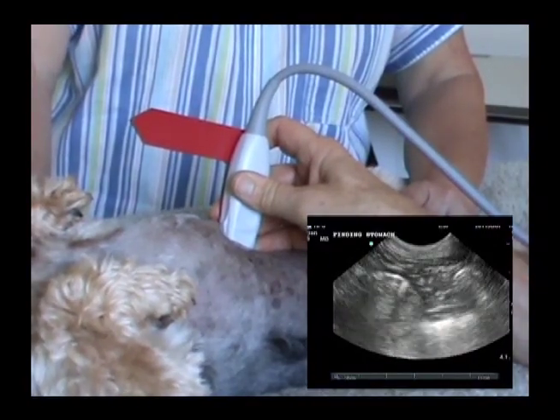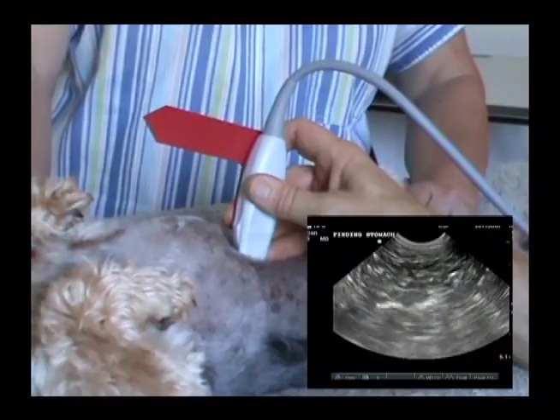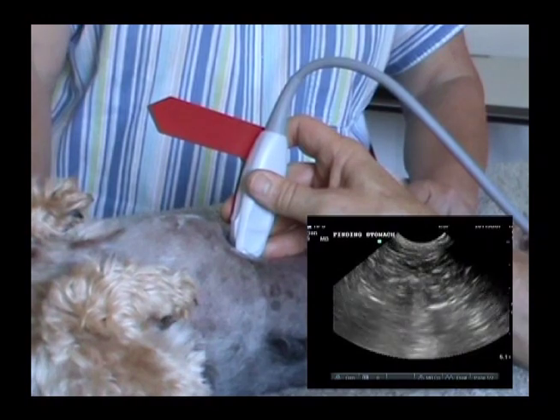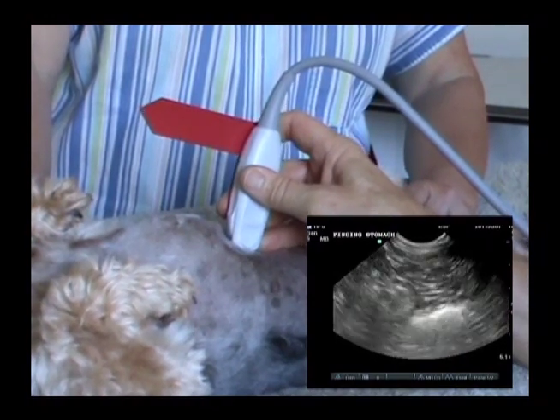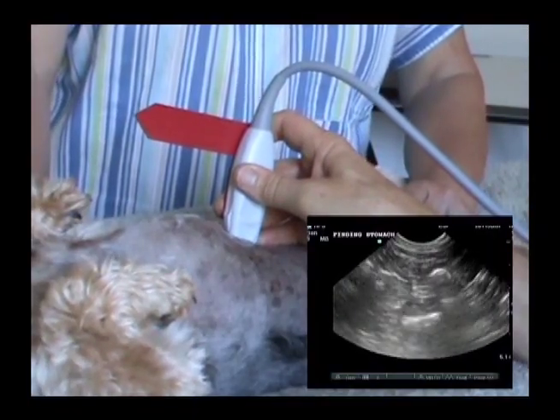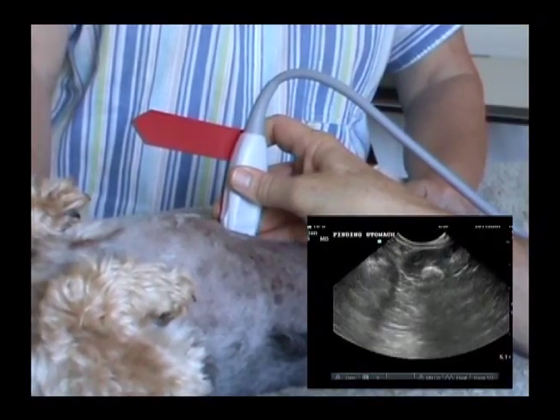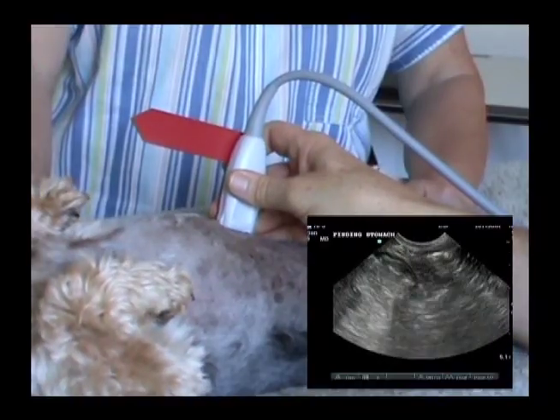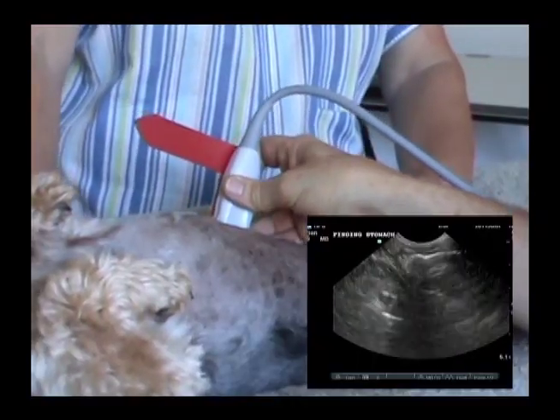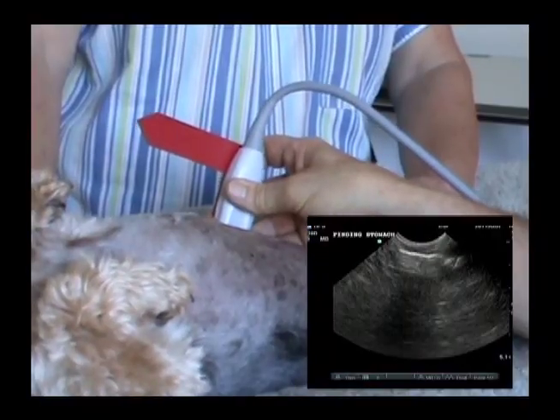The left limb of the pancreas is located between the landmarks of the caudal stomach wall and the transverse colon. Normal pancreas looks like fat, omentum, or mesentery, and usually is not recognized. Slide the transducer to the patient's right side till the stomach disappears. Adjust depth if needed. Then reverse directions and slide to the patient's left side till the stomach disappears. Try to keep the caudal wall of the stomach centered on the ultrasound screen.